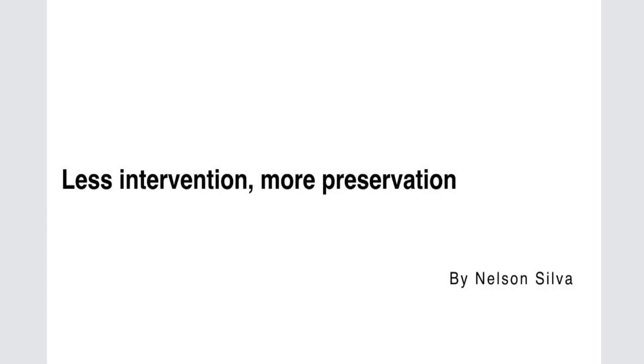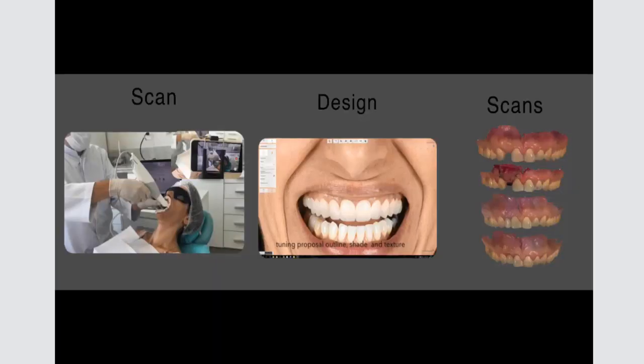And then when you come for scanning, intraoral scanning, when you propose to a patient that you can monitor them, maybe you can save one tooth and keep monitoring it with x-rays and also intraoral scanning. So this gives you less intervention and you preserve more teeth. We need to really focus on preservation. But we are in a time where implant therapy is available, and we all need to understand that implant therapy is important to all of us.